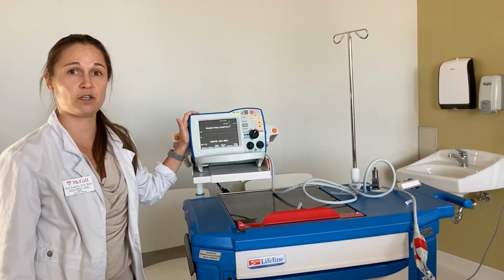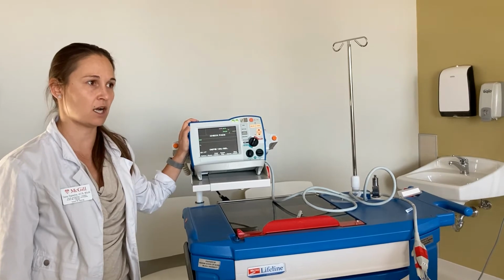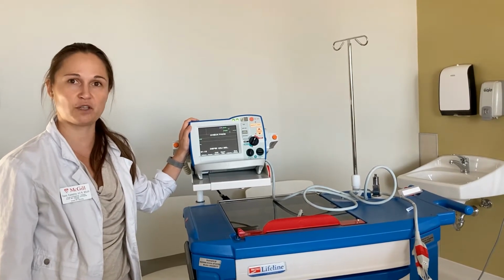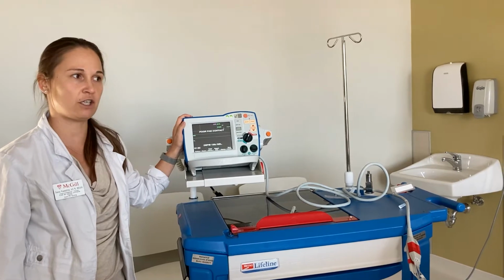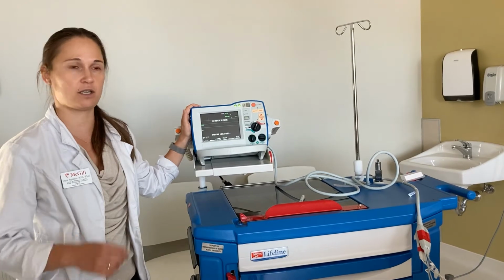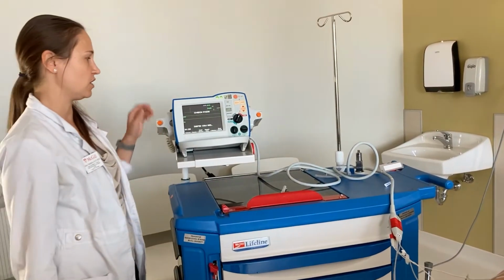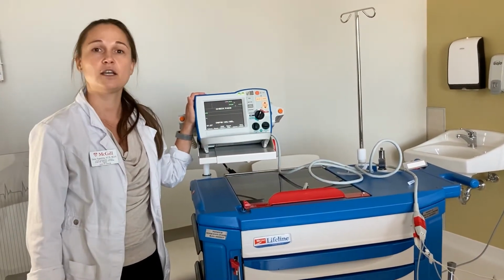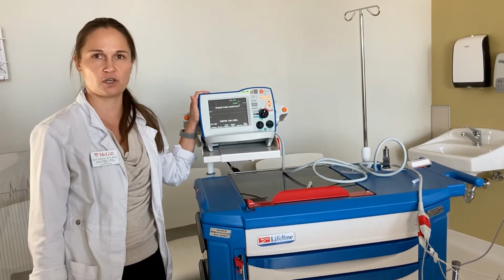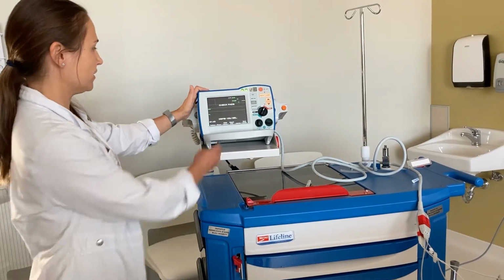So when we are cardioverting a patient, we need to make sure that our shock is not delivered near the T wave. So when we're cardioverting, we need to be able to monitor the patient's EKG, and the defibrillator needs to be able to deliver a shock just after the R wave. So the defibrillator is connected to the EKG leads that are on the patient's chest so that it can see the patient's EKG and so that it can time the shock that falls right after the QRS complex, somewhere on the R wave. So this is the sync mode.